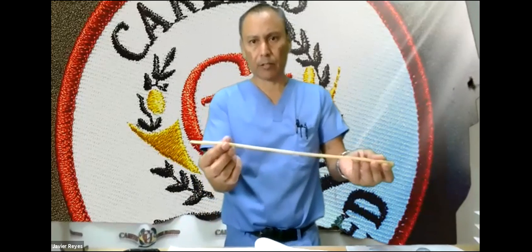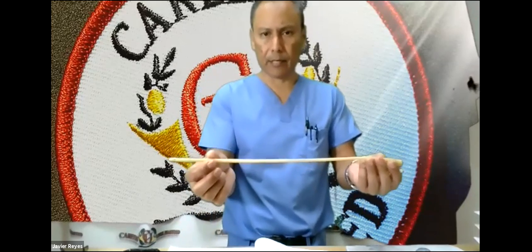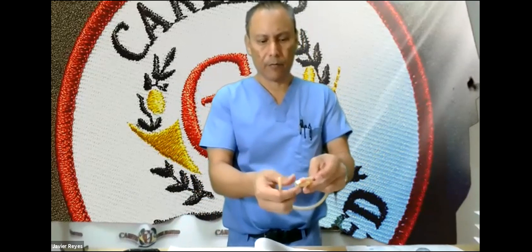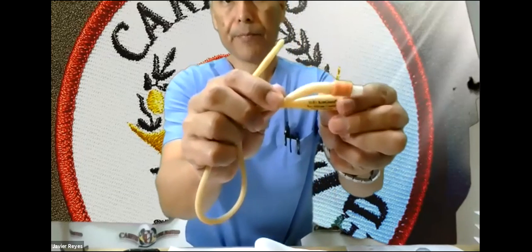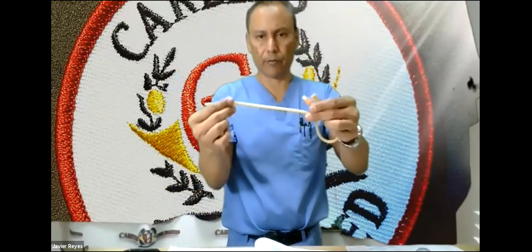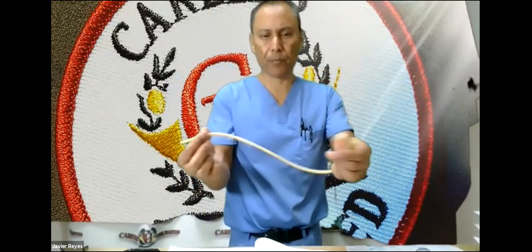Now, it's not one size fits all. There are different sizes. Just like needles have gauges, these come in sizes, but they call it French. French is the size. For example, this one is a 16. If you look really closely, I don't know if you can see the letters there, it says 16 French. 16 French is the girth or thickness. There's 18, 20, 22, 24. They come in even numbers, okay?